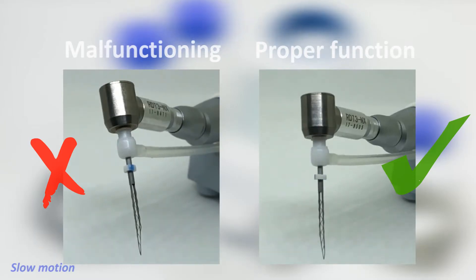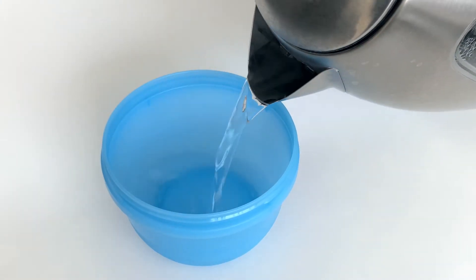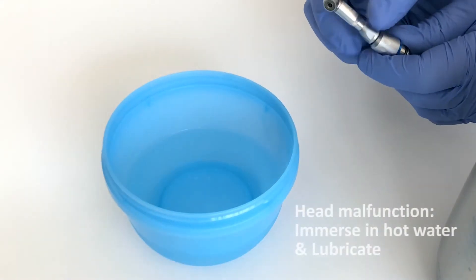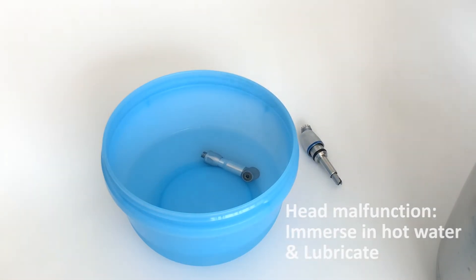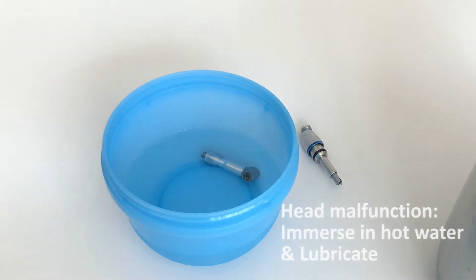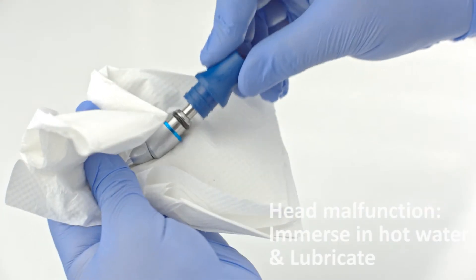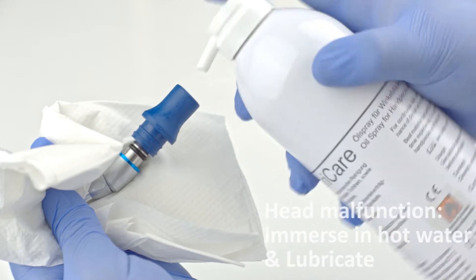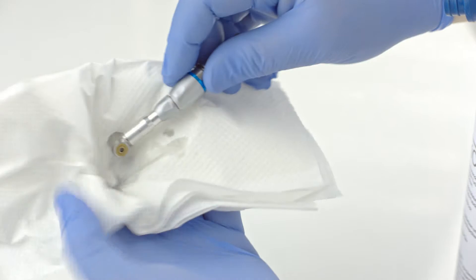The first sign of improper maintenance of the RDT3 head is usually that a file vibrates but does not rotate, due to sedimentation of sodium hypochlorite salts. Immersing the RDT3 handpiece head in hot water for a couple of minutes should dissolve the crystallized sodium hypochlorite, and when followed by lubrication, this should usually be able to fix this issue. However, do not neglect the need for regular maintenance, and if this advice doesn't help, make sure to send the head for repair by an authorized technician.